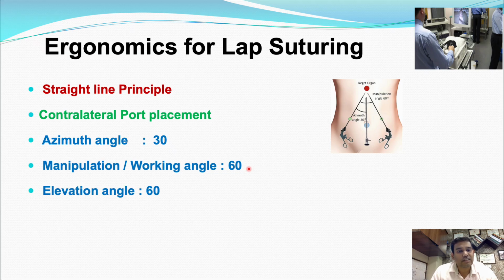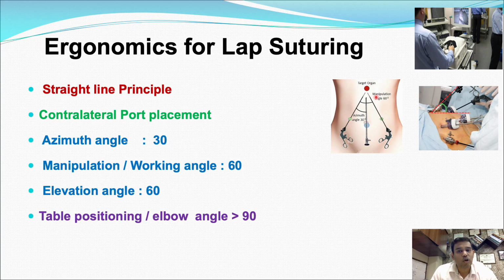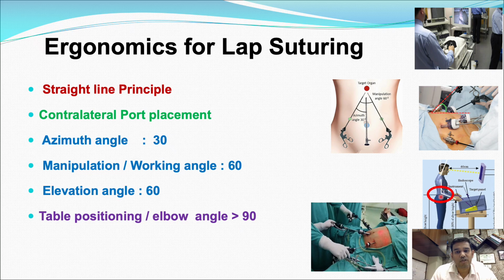There is something called the elevation angle. Elevation angle is the angle made by the patient's body with the instrument. So this is the elevation angle. You should have a 60 degree elevation angle that is equal to the manipulation angle for better suturing angles. The height of the table is also important while suturing. The elbow angle should be more than 90 degrees. That is ergonomically better for suturing.